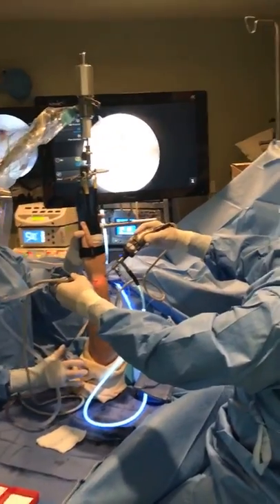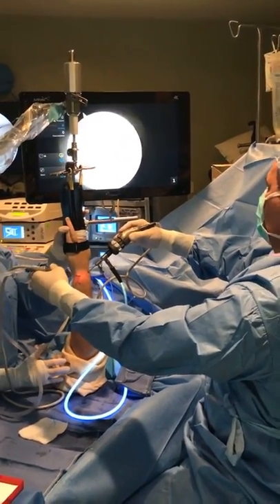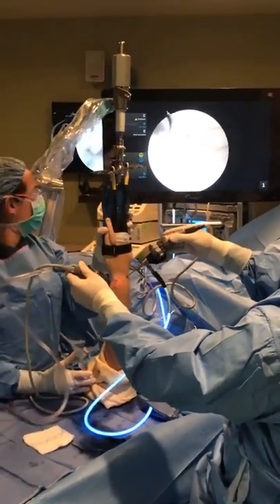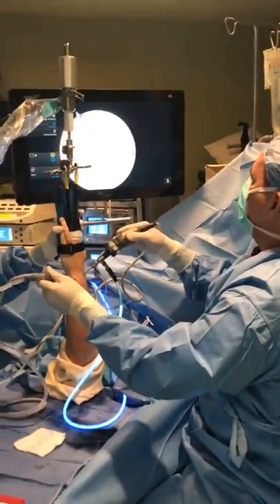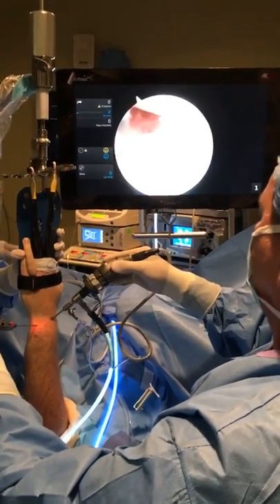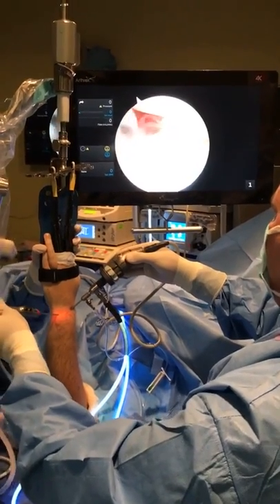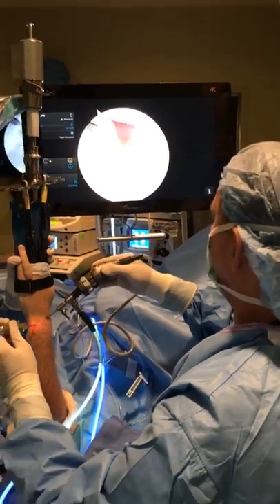All right, so I'm seeing it already, Kate. You notice the TFCC with the suction is lifting up. So actually, I'm looking forward to it. Next week, I'm teaching a wrist arthroscopy course in Barcelona. And I don't want to upset any of my colleagues. I think it might have been Andrea Atzei from Verona, Italy, who coined this term, the liftoff test. So I'm seeing this structure over here lifting off with the suction.